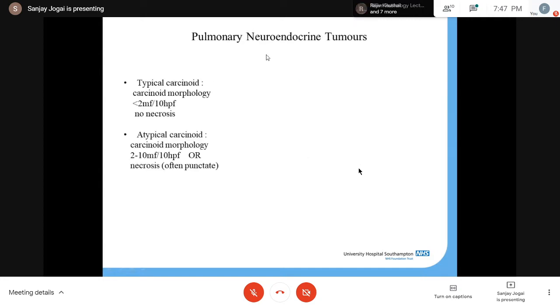Now, with that sort of background to the slide seminar, I'll just go ahead talking a bit about the neuroendocrine tumors. Now, we all know as far as neuroendocrine tumors in the lungs are concerned, we have typical carcinoid, atypical carcinoid, large cell neuroendocrine carcinoma, and small cell carcinoma. Now, with typical carcinoid and atypical carcinoid, morphology is not too distinct in the sense that they still show Zellballen pattern or nesting or organoid appearance.